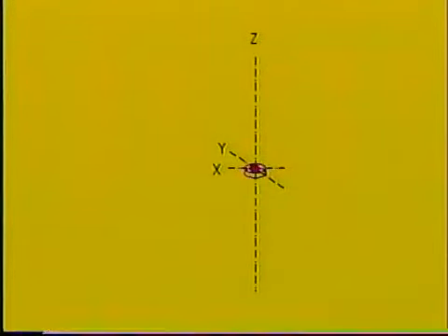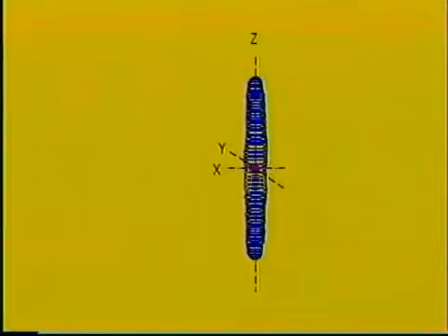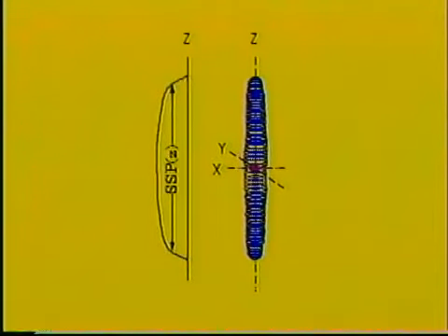The advantage of using the bead as a point source is that we can generate both the two-dimensional point spread function in the XY plane, or in fact the ellipsoid, the volume resolution, the 3D point spread function of a CAT scanner. In fact, when we take the profile along the Z-axis, we are generating the slice sensitivity profile in the Z-axis. We can alternatively generate this profile by stepping or moving the bead a small increment at a time, and by monitoring the peak CT numbers, we can generate the slice sensitivity profile.